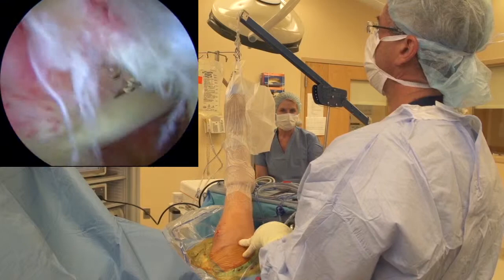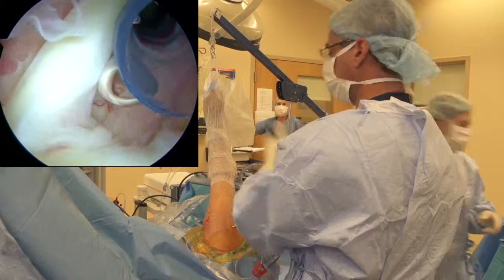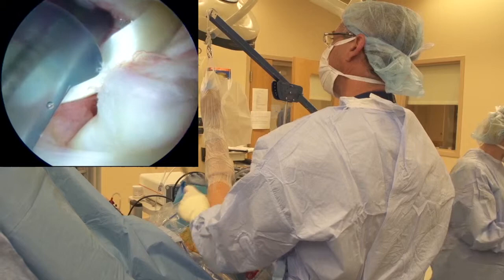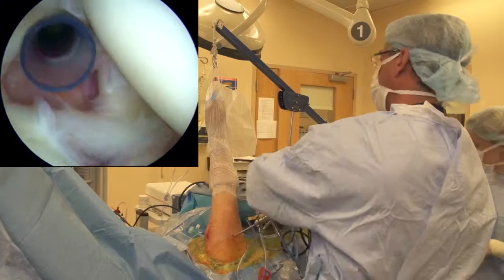Inside the joint here we can see our supraspinatus rotator cuff tear - we'll visualize that up in the subacromial space in a minute. Subscap looks pretty good. A little bit of posterior labral pathology here. In every shoulder you always want to carefully examine the biceps. I like to pull it into the joint to make sure there's no significant biceps tendon fraying. We can see that's a pristine looking biceps. The pulley system seems to be seated nicely. So: supraspinatus tear, subscap intact, biceps tendon intact.